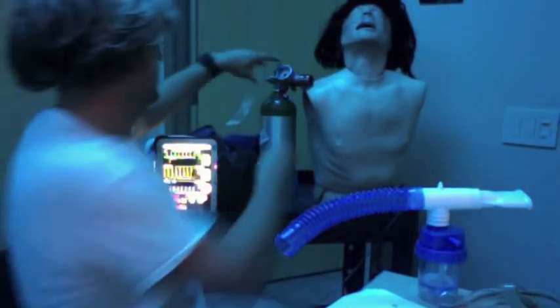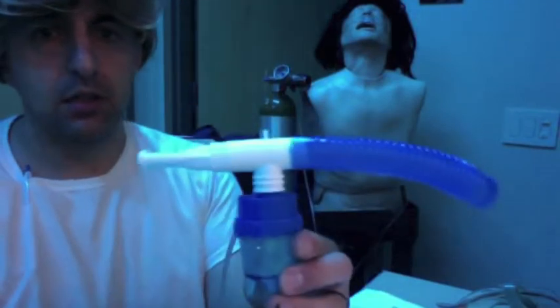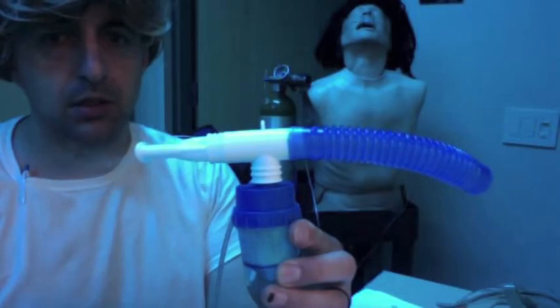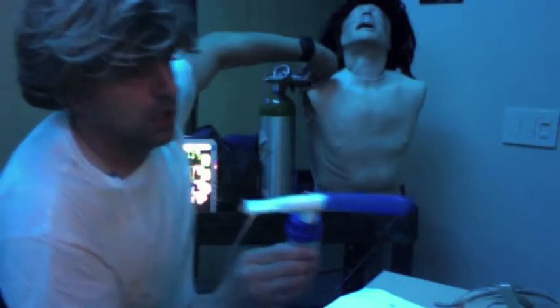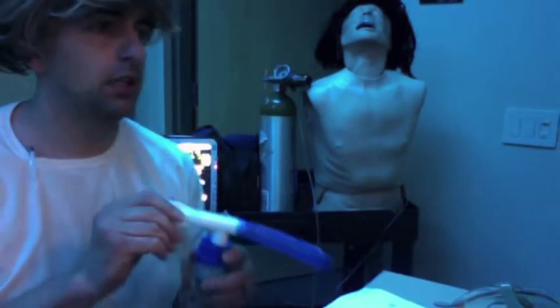We're going to hook it up to 6 liters, 6 to 8 liters per minute. And we would expect to see misting here and some bubbles here. I'm going to shut this off so you can hear. And then we're going to instruct our patient to put the mouthpiece into their mouth, inhale slowly and deeply, holding each breath for 1 to 2 seconds if possible.